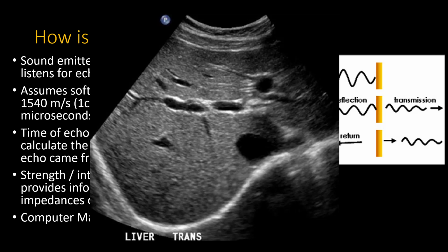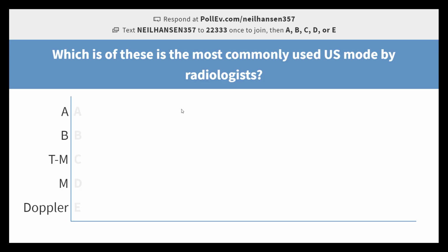And there's a lot that goes into making this look pretty. If you think about it, we have to manipulate things because the echo down here will be more attenuated and scattered than the echo coming back from up here. There are things which you can manipulate to make that look better. There are things you can manipulate to specifically image a structure. Say you wanted to look at potential thrombus in this hepatic vein here. Lots of different ways we can manipulate this image.